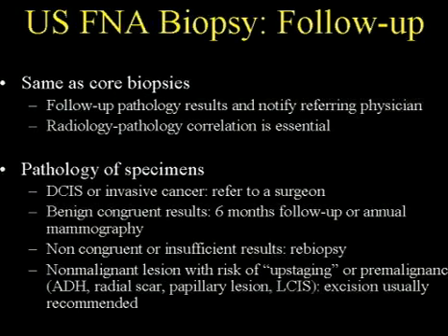So for FNA, again, the follow-up is exactly the same as core biopsy. You need to follow up on the final pathology results, which are usually not changed. Again, correlation is essential, and notifying the referring physician, and then this is also the same as before.